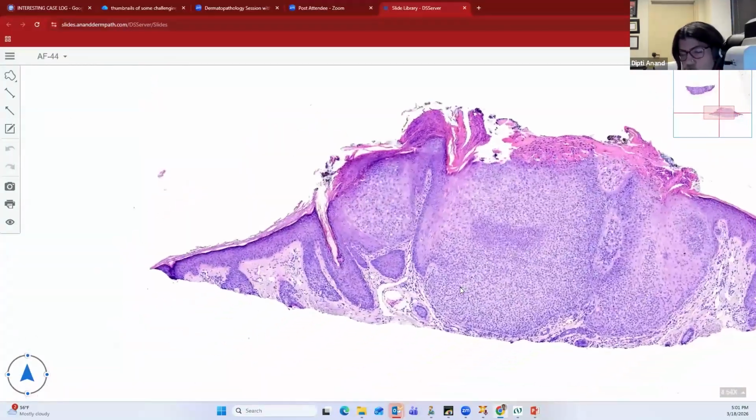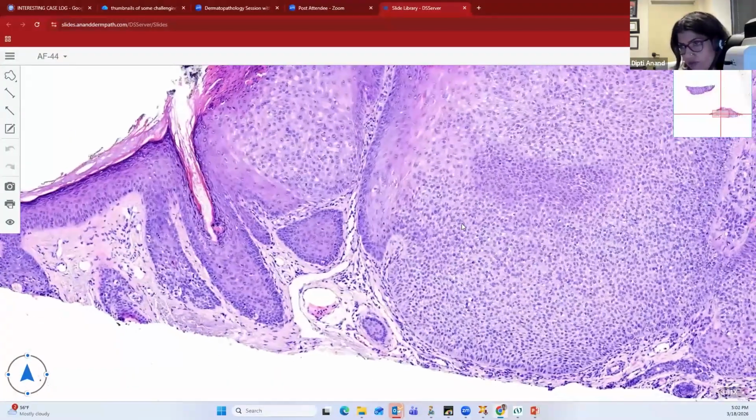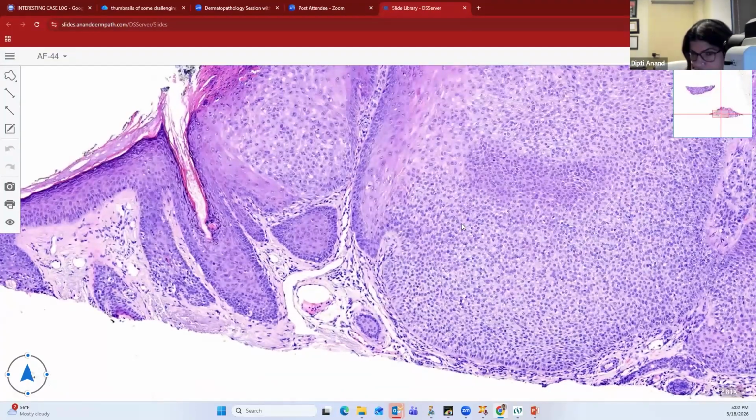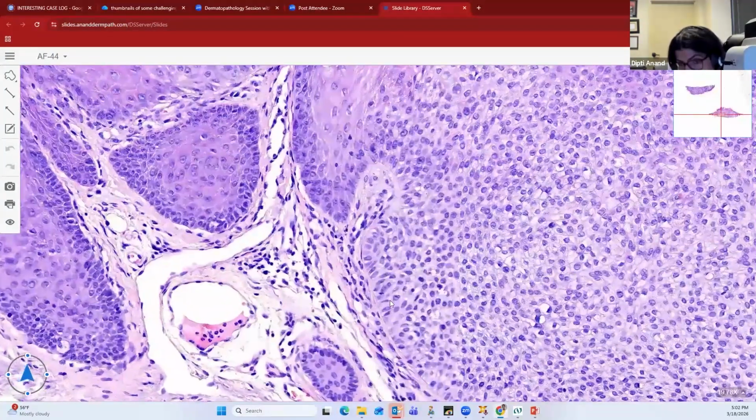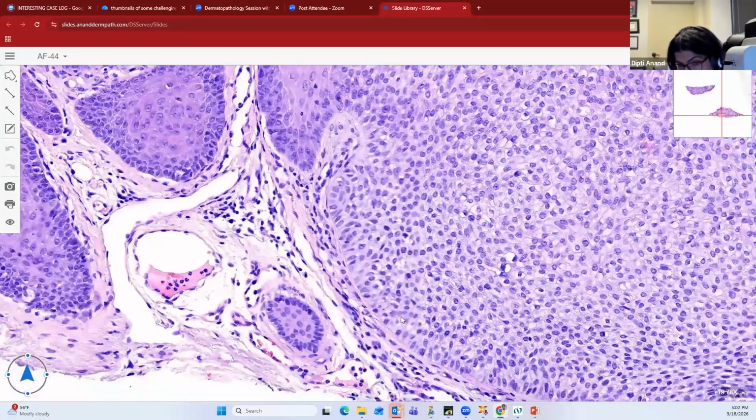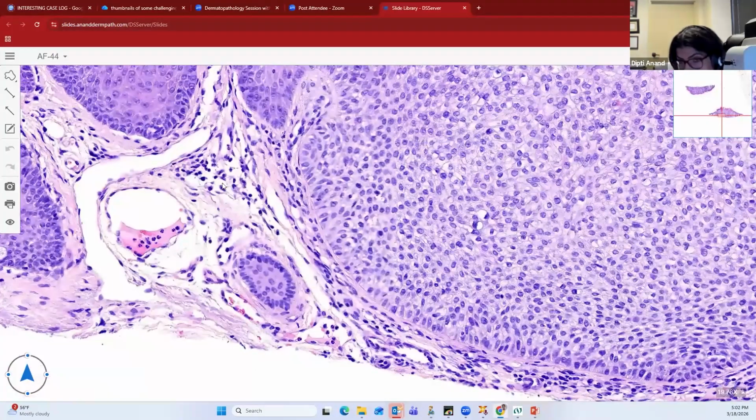An important clue for the tumor is to look on low power for the well circumscribed, smooth edge of the tumor. At the periphery the cells are basaloid and lining up, which is called picket fencing, but there is no retraction from the adjacent stroma. And then the inner cells of pilar sheath are much paler.